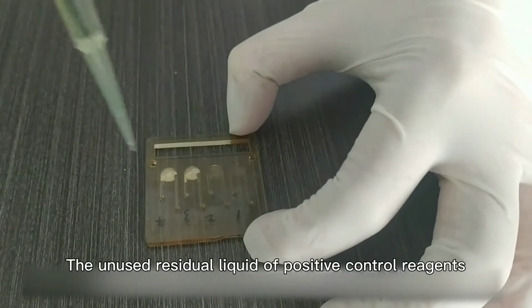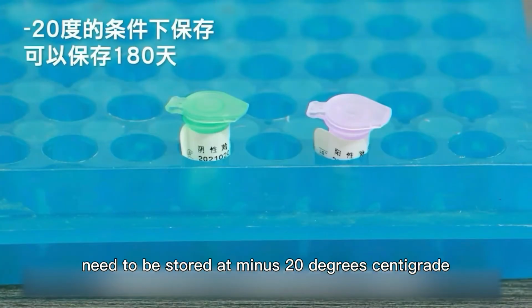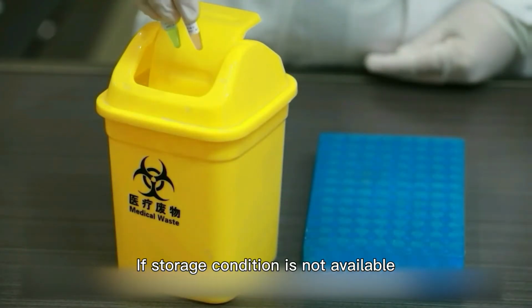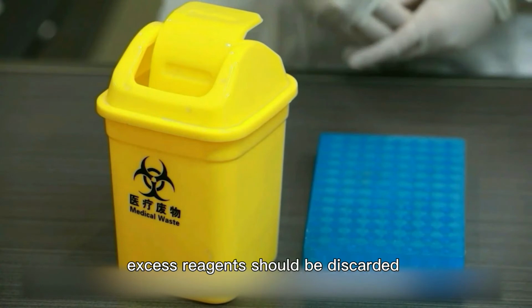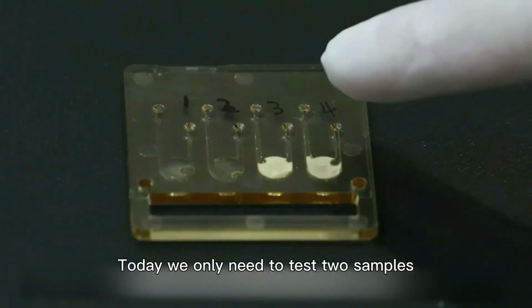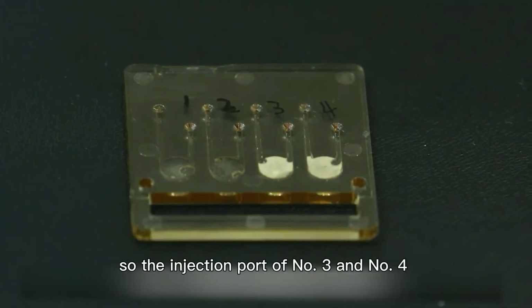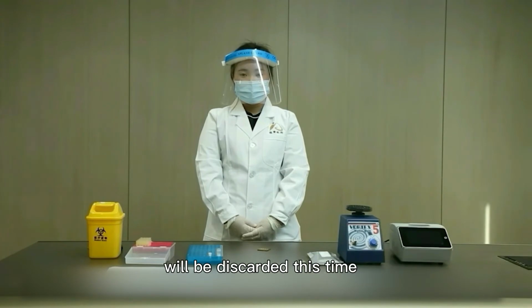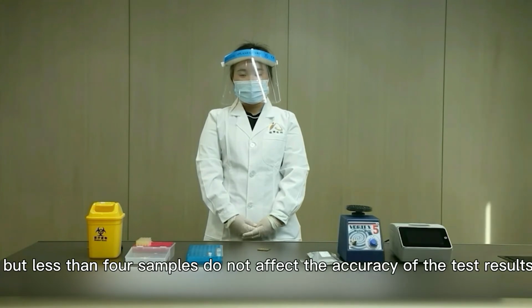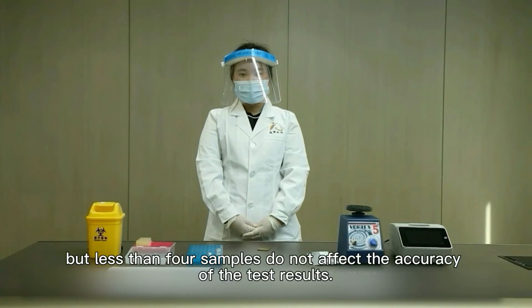The leftover liquid of the positive control needs to be stored at -20 degrees centigrade, which can be stored for 180 days. If storage conditions are not available, excess reagents should be discarded and prepared again when needed next time. Today we only need to test 2 samples, so injection ports number 3 and number 4 will be discarded this time. It's the most economical and environmentally friendly way to test 4 samples at a time. But fewer than 4 samples do not affect the accuracy of the test results.